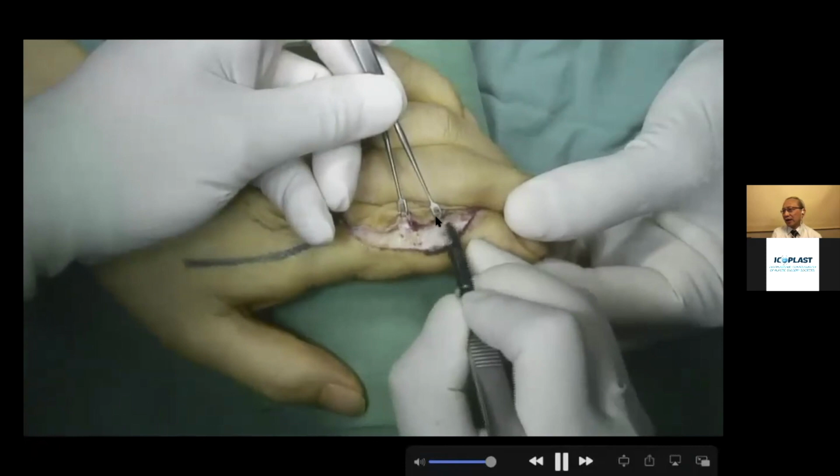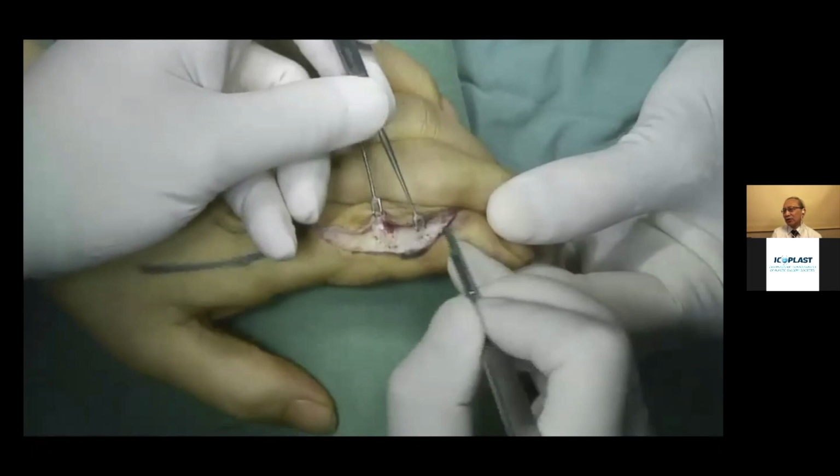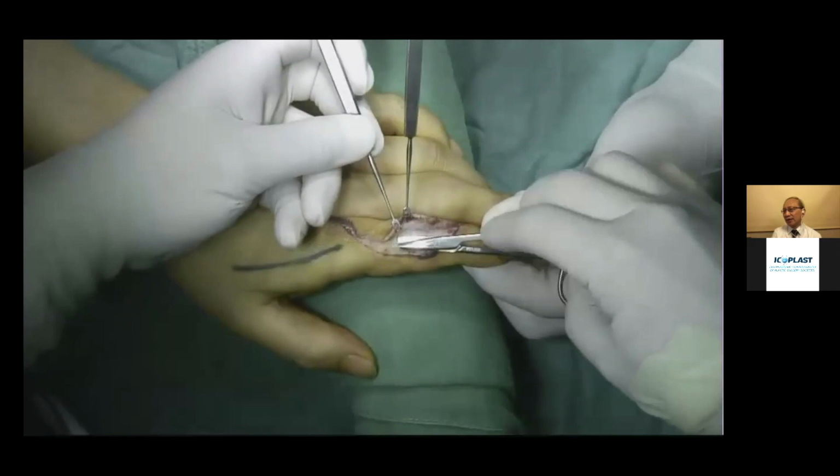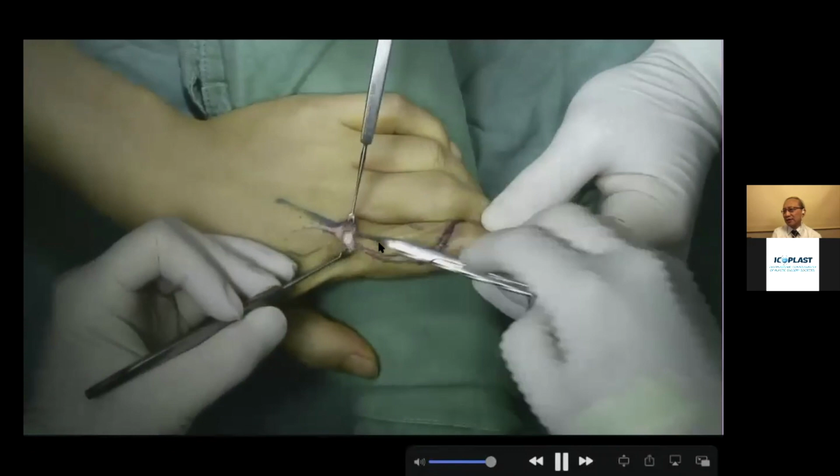If there are a lot of scars, just use the bevel to do the dissection. Do not use the cautery, and not even the bipolar. Just use sharp dissection of the tendon, to try not to cause more injury to the tendon. And when there are fewer scars at the proximal phalanx, we can dissect with the scissors again.